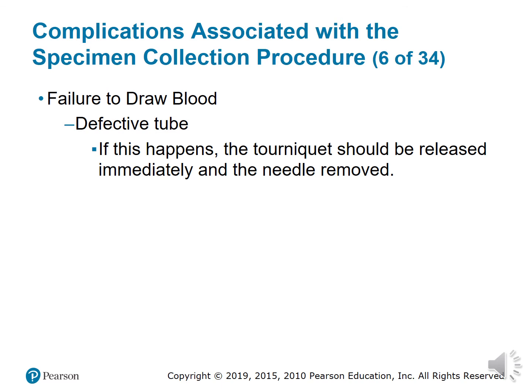I didn't mention it, I just went ahead and jumped to the next slide. But this part right here is just to clarify: sometimes the top will come off the tube. When you put it in the hub, I see that people sometimes tend to turn the tube. You want to turn it to the side where you have the space between the stickers to see the fill line. To ensure that the tube is being properly filled, that turning could, if the tube is old or getting close to expiring, make the top come undone. And now we have a whole mess.